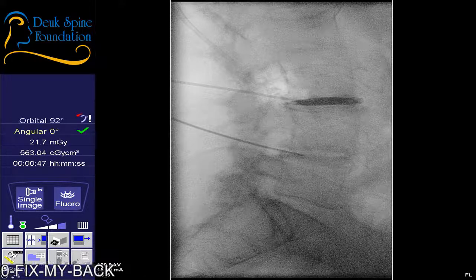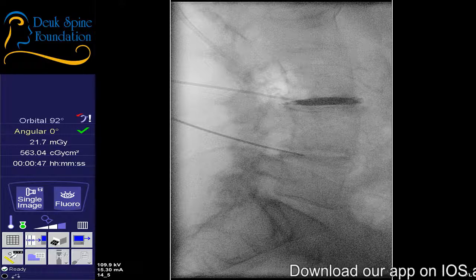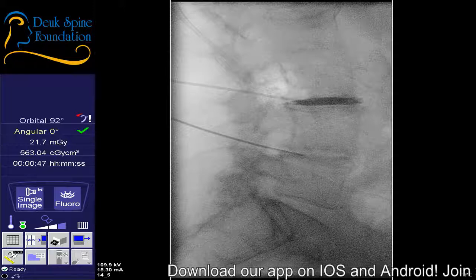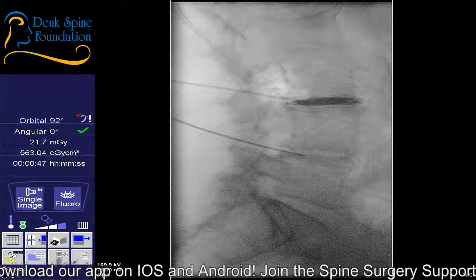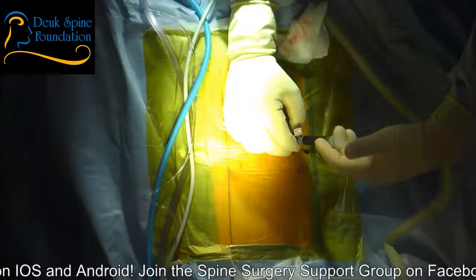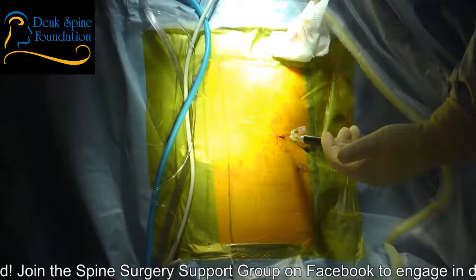So we just tested that disc that I'm in, and we got a beautiful discogram. You can see the disc is now filled with a dye. It's black on the x-ray. And the patient experienced 10 out of 10 pain that she normally gets every day. So I know for sure that once I fix this disc, that pain will be gone, because we're going to use the laser to repair the tear in the back of the disc, and that's what makes the Deuk Laser Disc Repair a unique procedure where I repair the tear that causes the pain that she just felt. Now the dye itself causes an activation of the nerve fibers that are along the tear, typically causing pain.